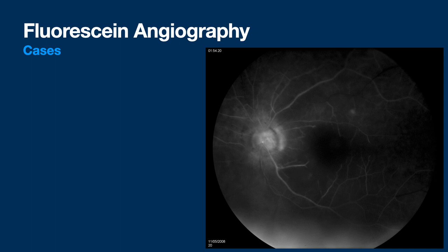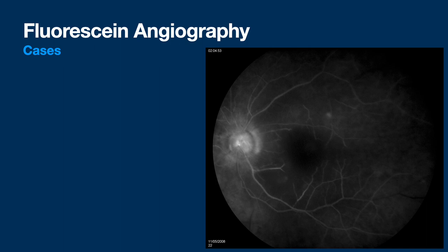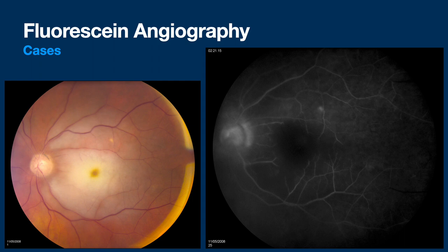There's really not much capillary perfusion around the fovea in the macula. Then we see a cherry-red spot — or rather a tomato-yellowish cherry — and all that opacification of the retina. This is CRAO. I called it a CRAO at the time as a fellow, but probably there was also some component of a choroidal infarction or even an ophthalmic artery problem. Very bad. We're not going into management of all these right now.